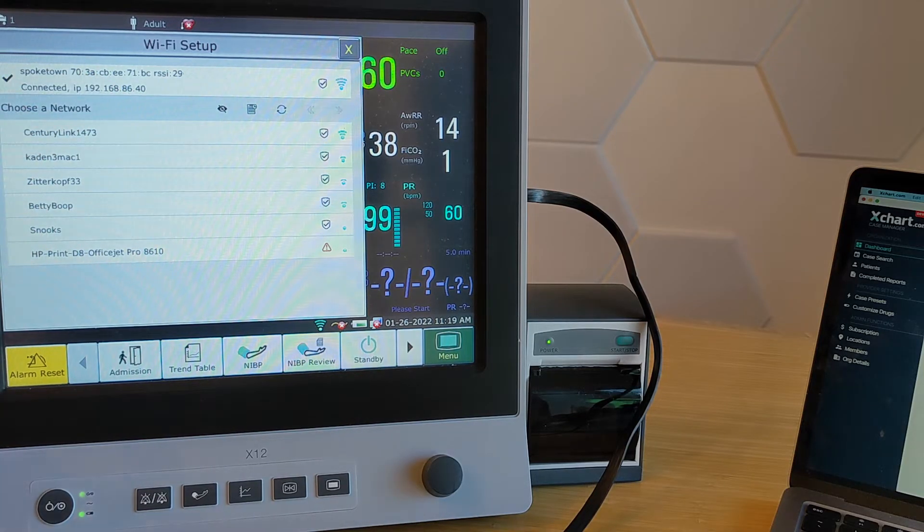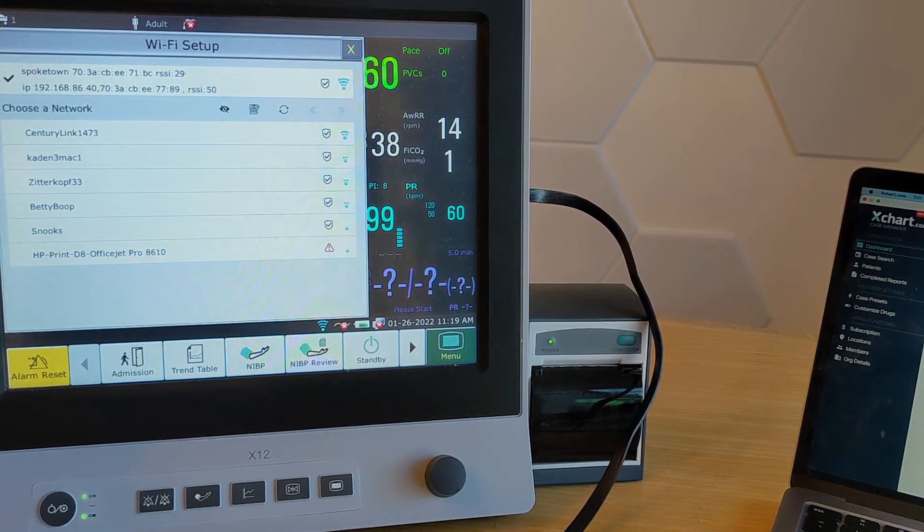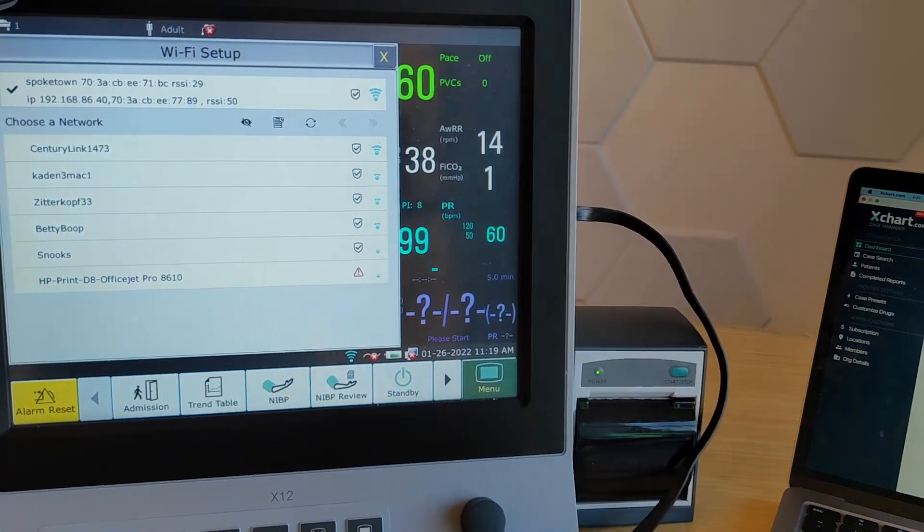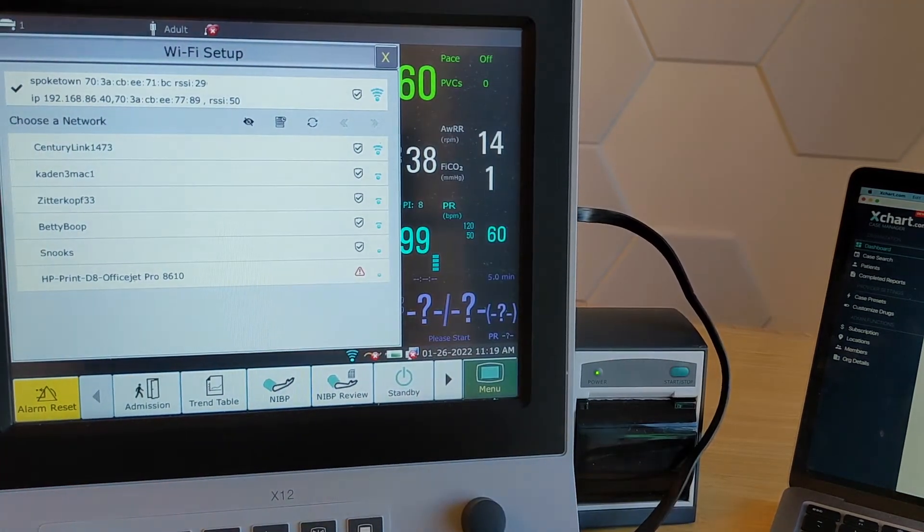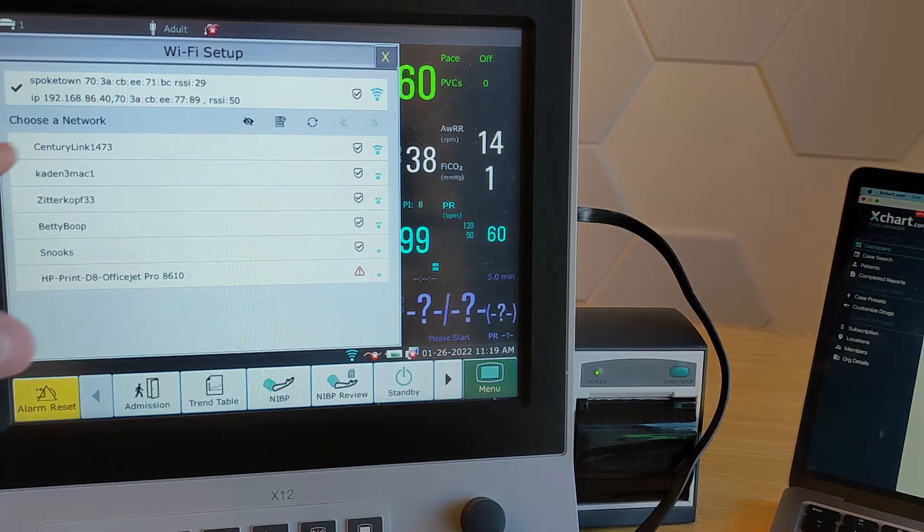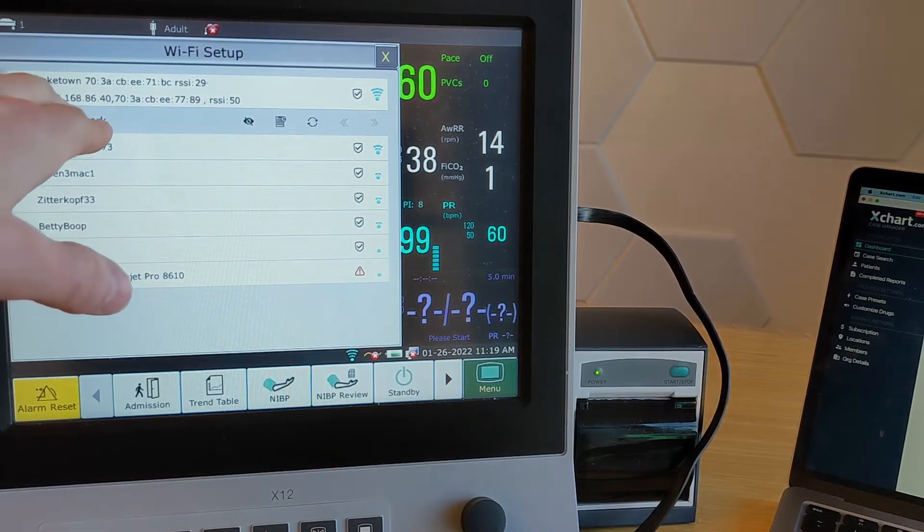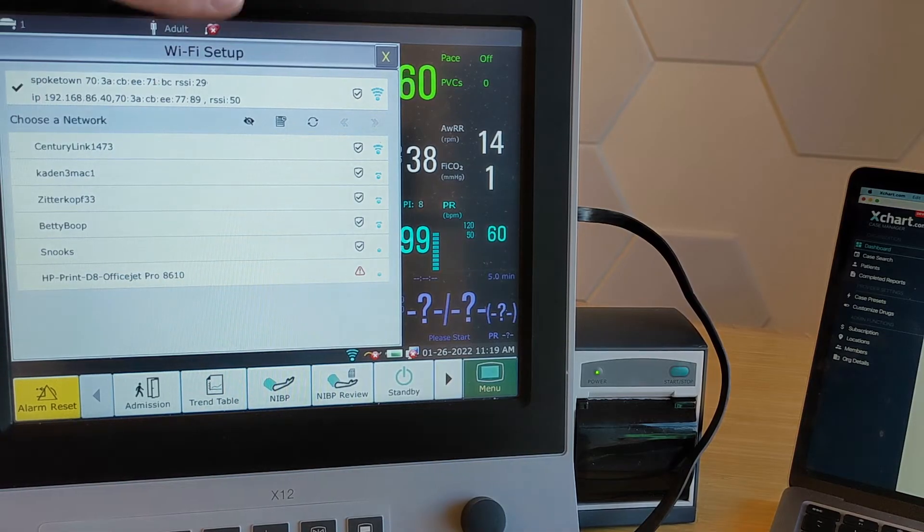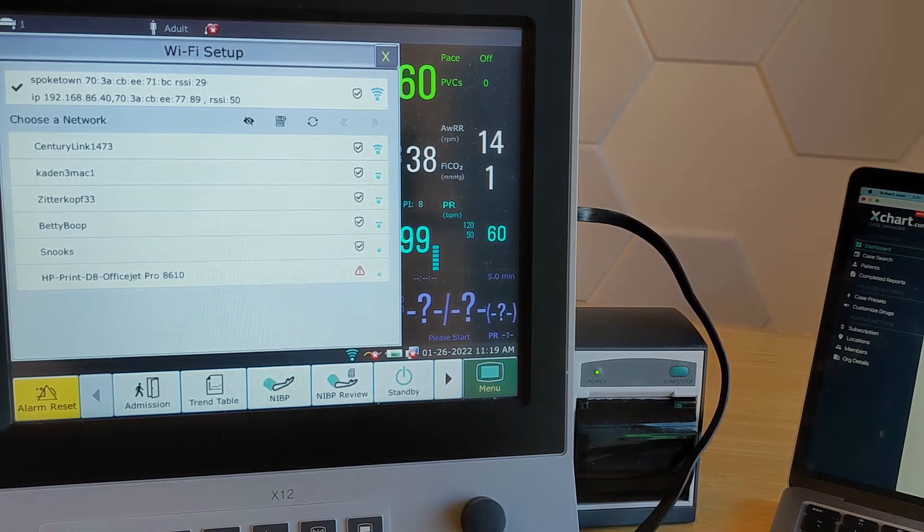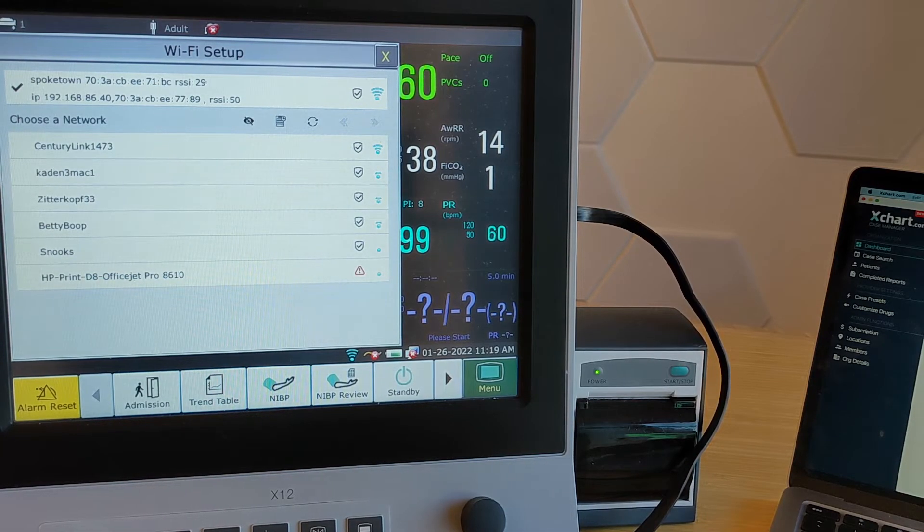and pretty soon you'll get an IP address here as well. So again, that IP address is something you might need later on, depending on how your network is set up. So that's how you find the IP address of the machine if you need it on a Wi-Fi connection.